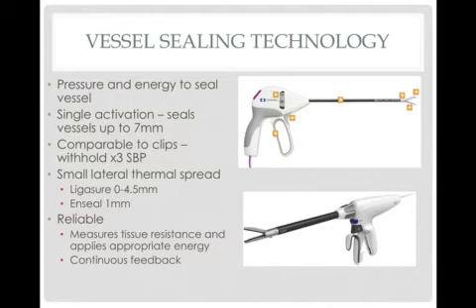So besides the hook diathermy, we have the vessel sealing devices, such as the LigaSure and the Enseal that can withstand up to 3 times the systolic blood pressure, much like surgical clips.